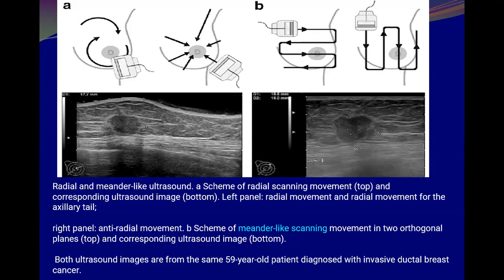the long axis of the duct related lesions. I will rotate, I will angulate my transducer more obliquely until I could reach the maximum length, the maximum dimension of the lesions. When I get the maximum dimension of the lesion, that means I am in the radial for that duct. Radial alignment of the ducts. You got it now. Yes.